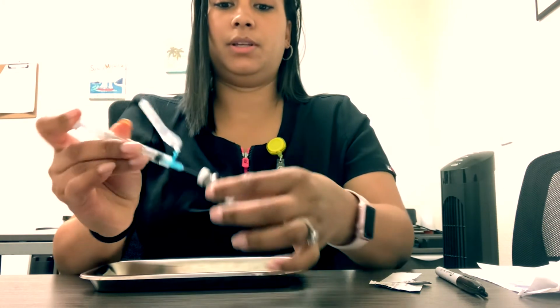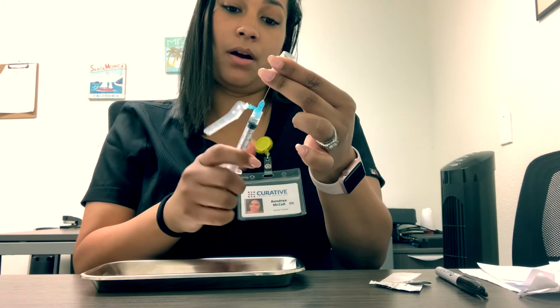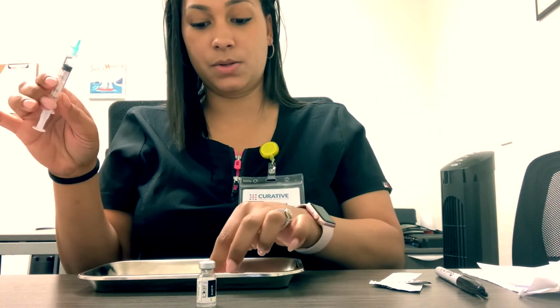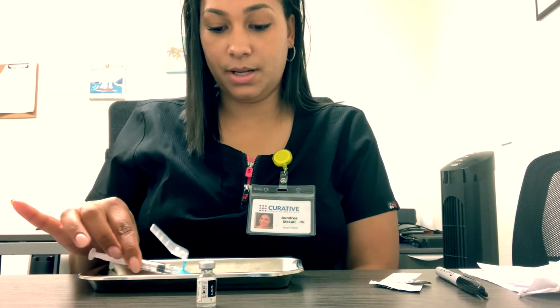We will gently invert, draw back our 0.5 mLs, stabilize our vial back on the table, and take the needle out. If you are the prep nurse, you will have to use the one-handed scoop method. Make sure that you're not touching any dirty surfaces with your needle. So go ahead and use the one-handed scoop method.